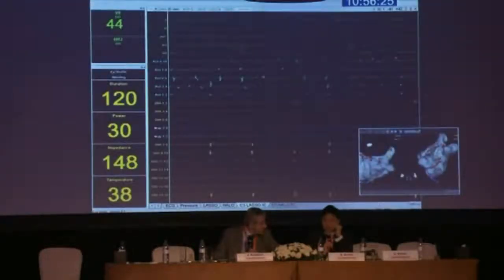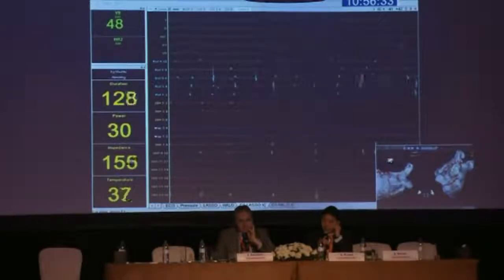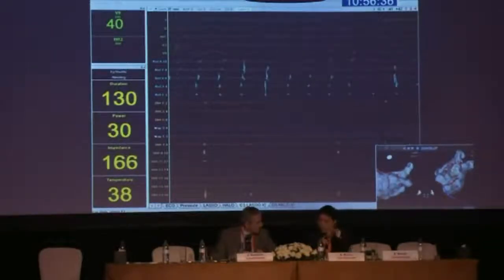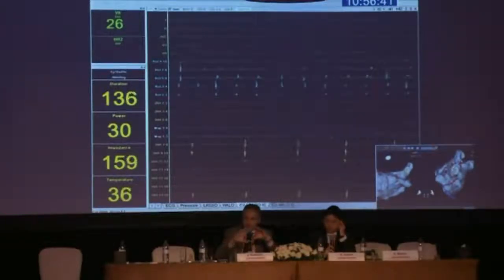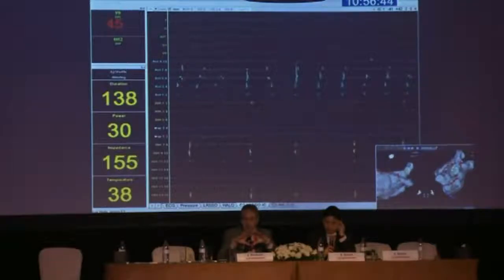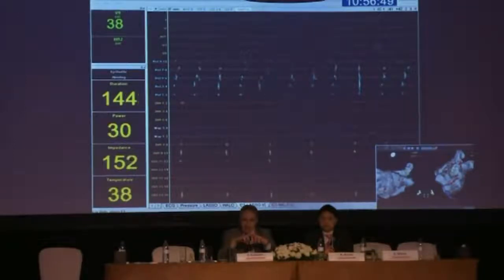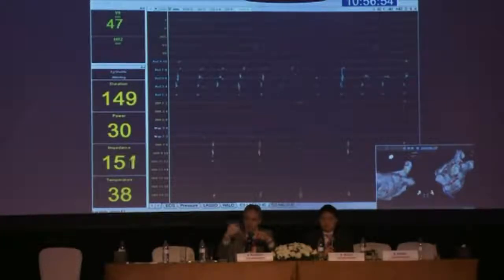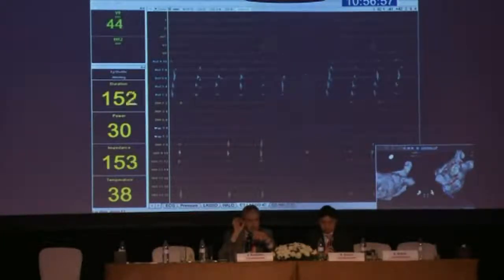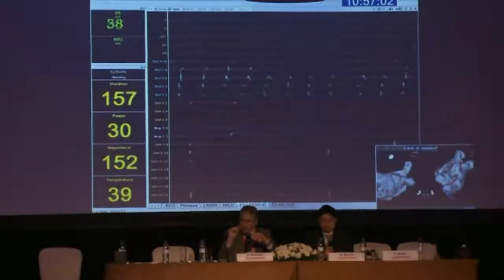I suggest that there's only one entry point into the vein. Yeah, there's only one entry point. Because obviously the fascicle can be just one tiny fascicle that feeds into the whole vein. So I think that's probably the interpretation. There is tremendous variability from anatomical studies. I was part of one study, and we analyzed post-mortem, and these fibers are crisscrossing. So although there is some sleeve around the whole circumference of the vein, the conduction could go preferentially only in one area. So even with few points, you can isolate the whole thing.